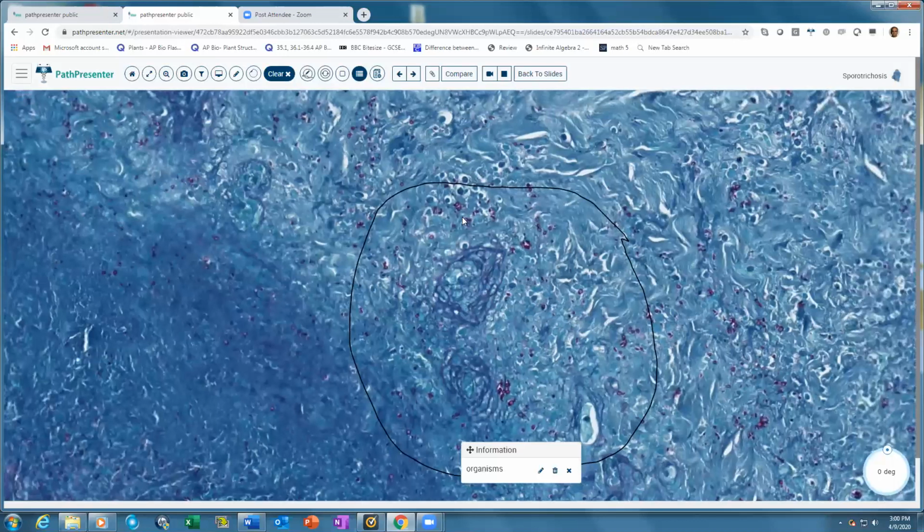So you see all these rounded structures. These are usually cigar shaped. Some of them are cigar shaped. They are usually 2 to 8 microns, and some are round, which are 4 to 6 microns, yeast forms actually.